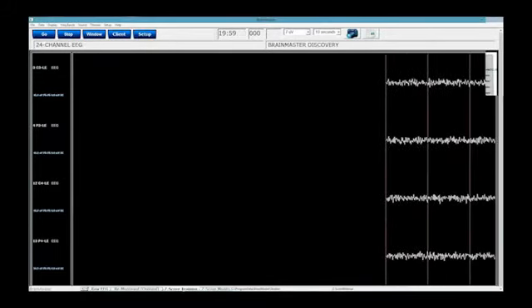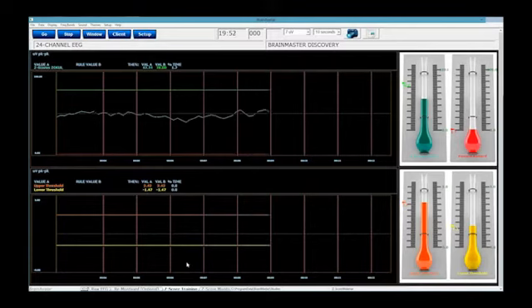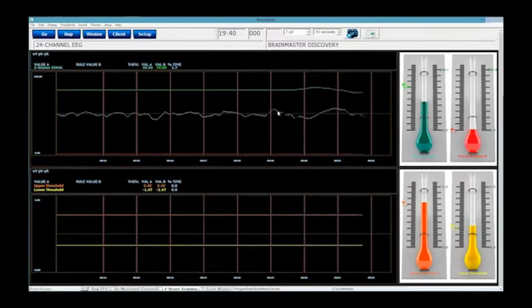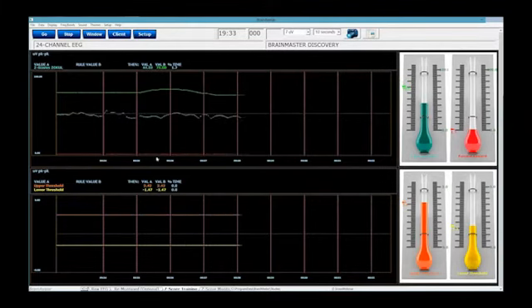And now let's look at my ZScore training screen. You're going to notice that this screen looks very similar to the previous ZScore screen that we had. Up here you've got your ZScore PZOK UL that's going on, and it's popping along. My C key is exactly the same: I'm holding the Shift C and it's going down, and I'm hitting the C and it's going up. You're going to notice that right down here is where the biggest difference is.